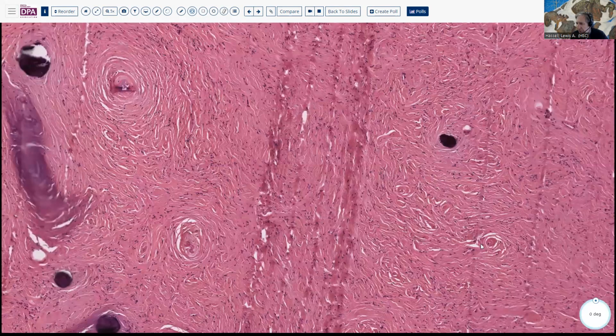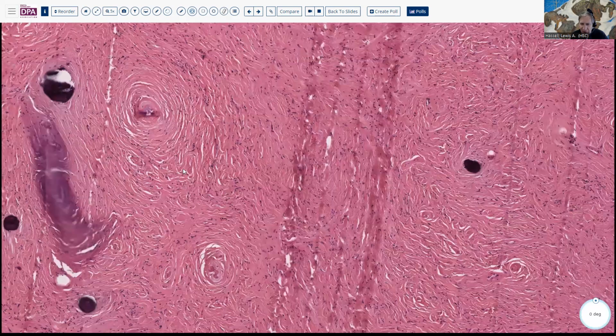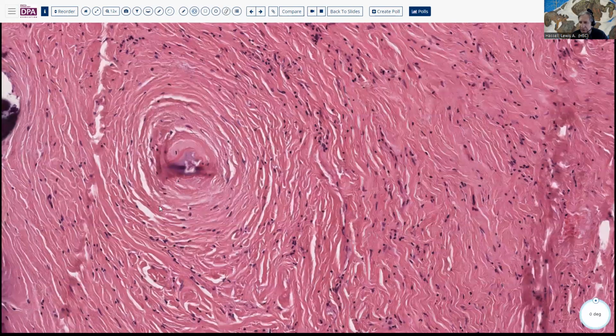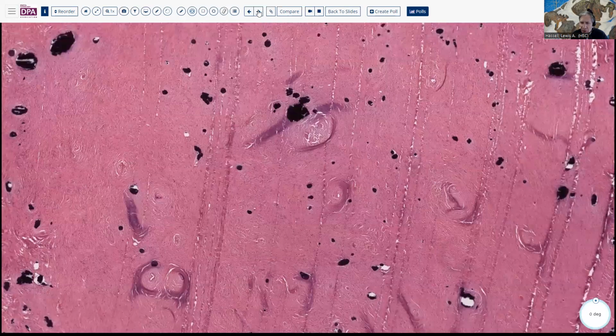Sort of in these little areas, as you see here. Here's one that's sort of incipiently calcifying in that location. To my knowledge, these are not specifically associated with any known syndrome or genetic abnormality, but it may be that we just haven't studied very many of these.